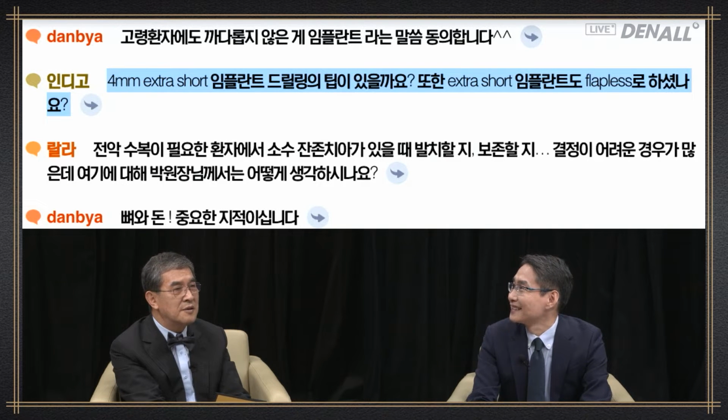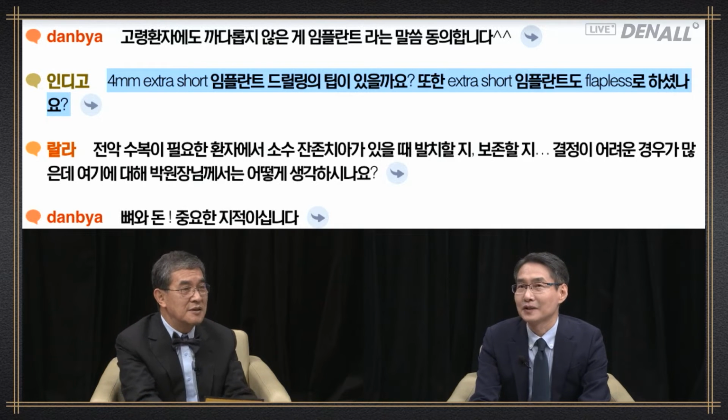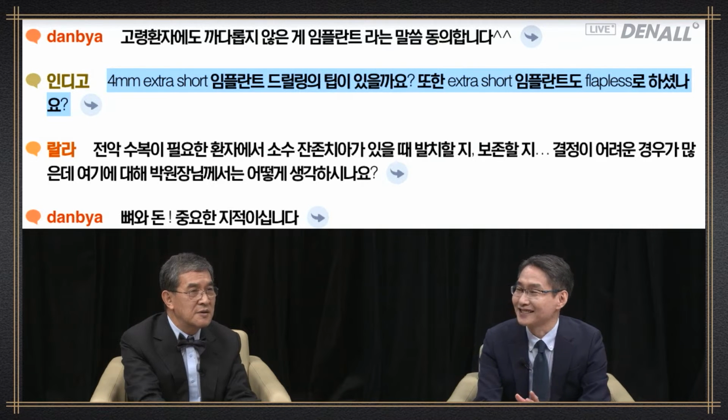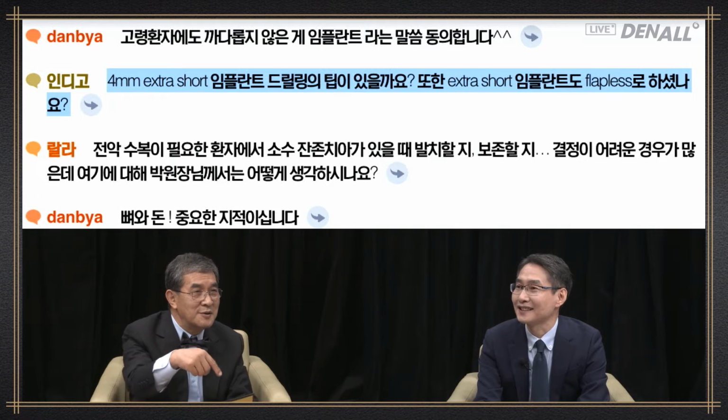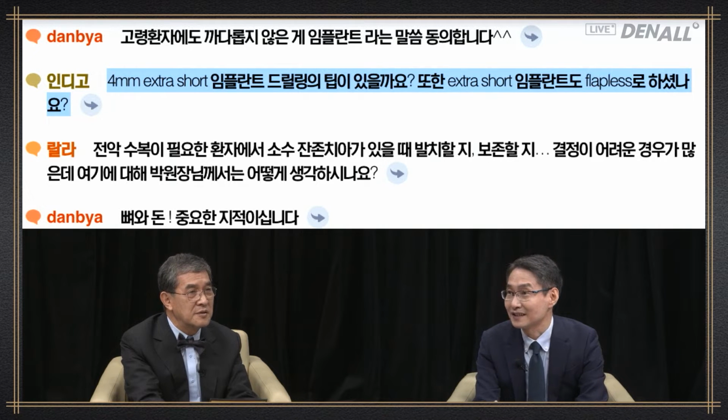However, when you use it, in reality, it's not easy. In getting primary stability, it's very technique sensitive. If you make a mistake during drilling, you may not be able to get primary stability at all. Even with a slight bone loss, the implant can fail, so we need to be very careful.